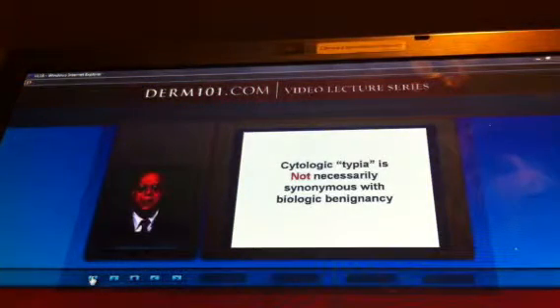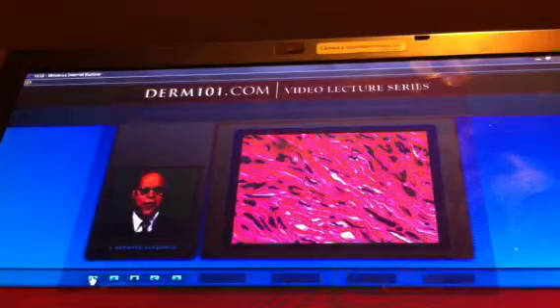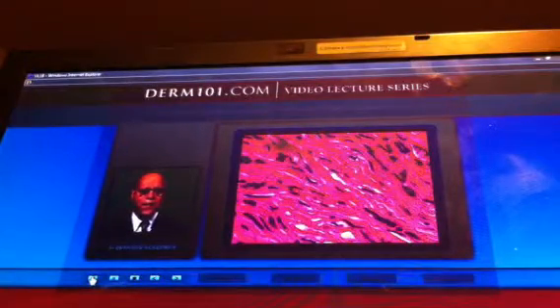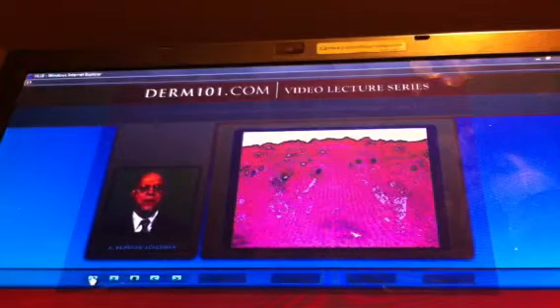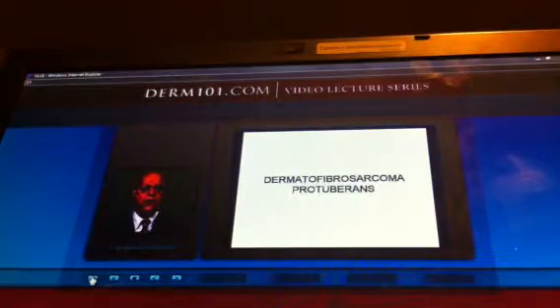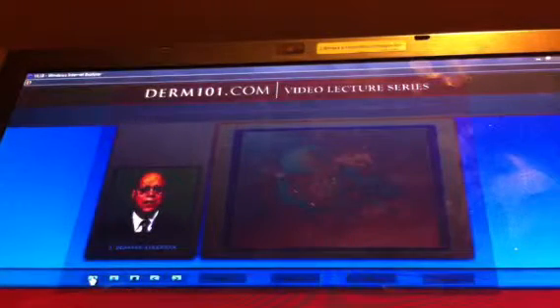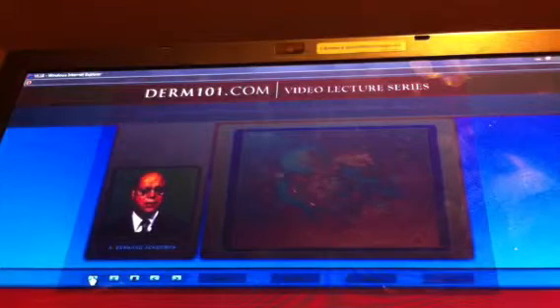Cytologic atypia is not necessarily synonymous with biologic malignancy. Look how small and thin these nuclei are. At lower magnification it becomes obvious that this is dermatofibrosarcoma protuberans — it is a sarcoma, and it is malignant, but not associated with any cytopathologic atypia.